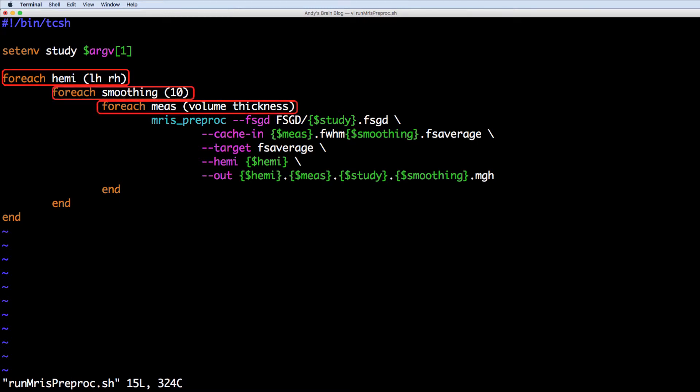Here I'm analyzing both the left and right hemisphere, only looking at the 10mm smooth maps, and focusing on volume and thickness.